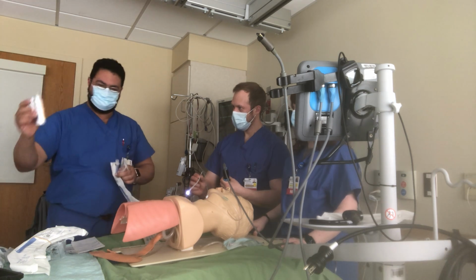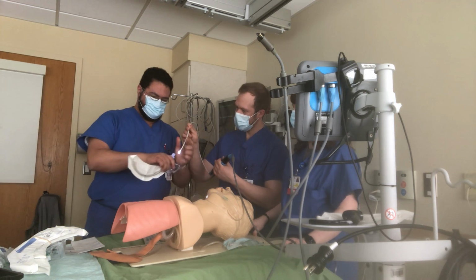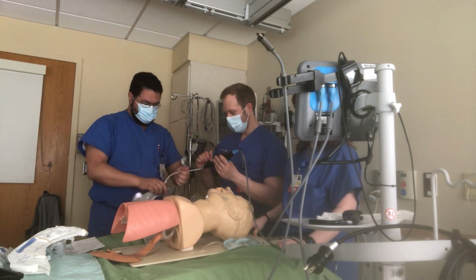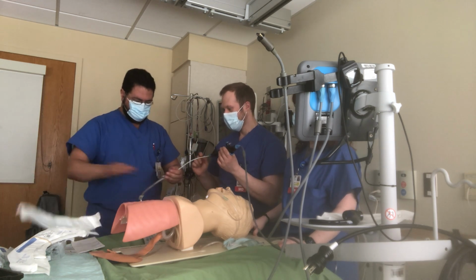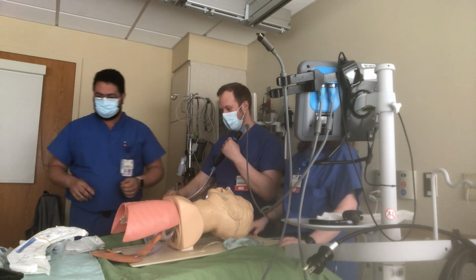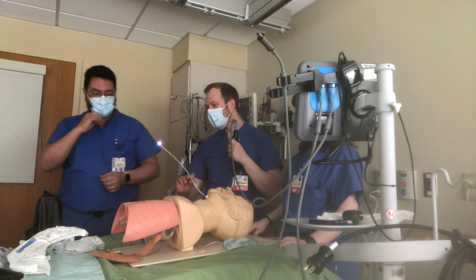This is lubricant. This actually works as a lubricant. We put it through, and look here. There's something to hold it here, right? So it stays up. It was one of those stupid things that the anesthesiologist said.